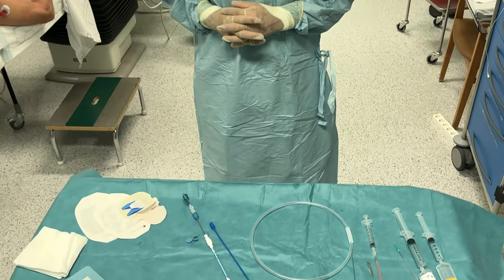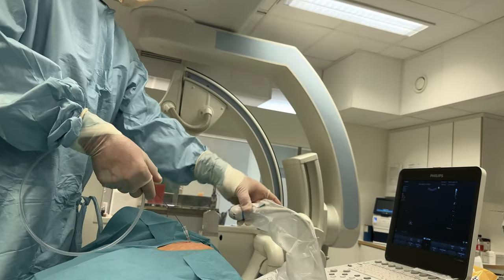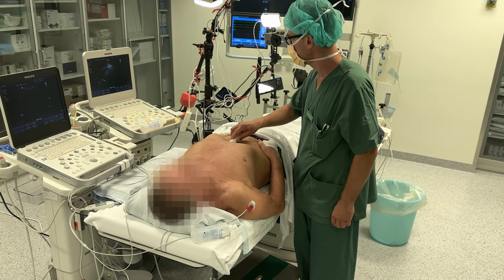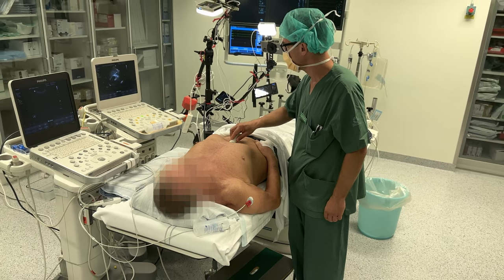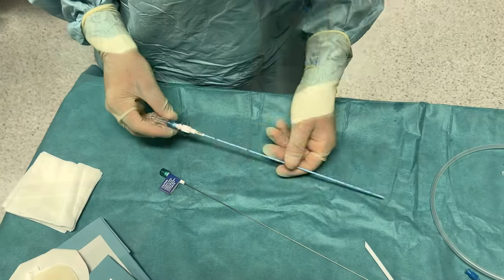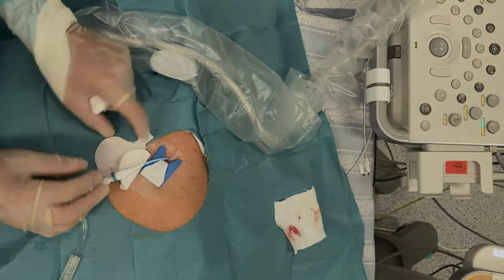Compared to the conventional sub-xiphoid approach, ultrasound-guided pericardiocentesis allows for several access points to reach the pericardial fluid. Patients who would otherwise be deemed too difficult and only get a drain when in critical condition can now get it safely, without inadvertent puncturing of vital structures such as the lung, stomach, or the right ventricle. My name is Robin Lunden, and my collaborator is Ola Borkvist, and we are anaesthetists and ICU consultants at Skåne University Hospital in Lund, Sweden.